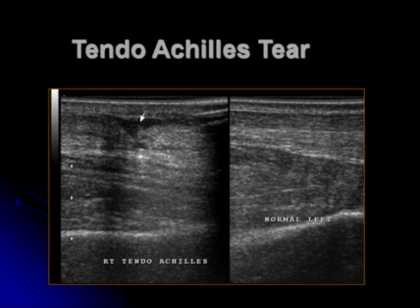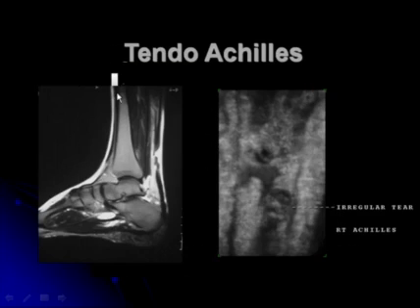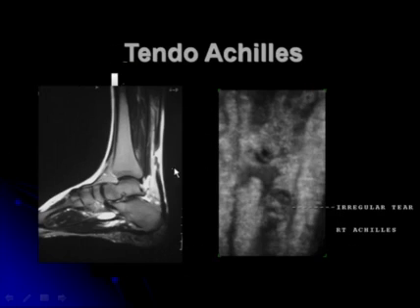The other aspect of tendons is tears. Here is an example of a tendoachilles tear, with the normal tendoachilles on the other side for comparison. This is an MRI and a 3D coronal reconstruction of the same tear of the tendon.